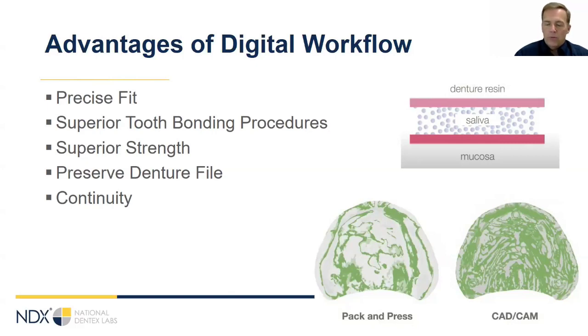So it'll be helpful for you. Like, let's say a denture gets lost or broken. You can say, oh, hey, I got the files here. It was whatever kind of denture it was. Can you guys remanufacture it for me? And you can rest assured that the piece you get back will be the same as you delivered to the patient. Digitally, the process has more continuity.